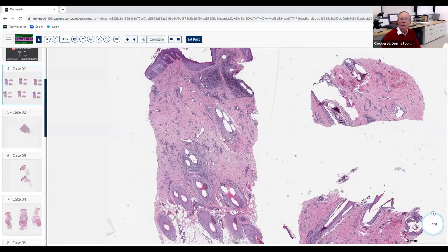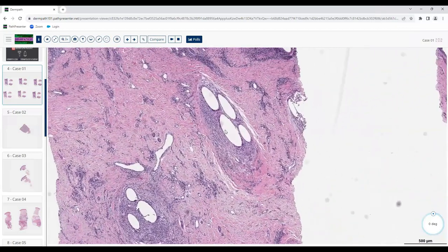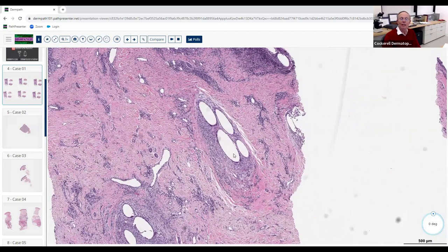Looking at these other follicles — do you see anything at this power? It looks like there are multiple shafts per follicle. Yes, exactly. What's probably happened is multiple follicles have been affected by the same inflammatory process and grouped together, forming what clinically people refer to as 'doll's hair' — like those dolls that have four or five little plugs of hair coming out. This actually happens in certain inflammatory alopecias.